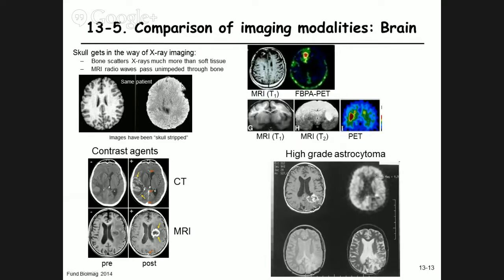It's got stronger contrast. Is that T1 or T2 weighted? I hear T2. Everybody agrees? Yeah, so this is also T2. The difference between these two is the echo time. So here's T1, post contrast. This is MRI T2, two different echo times. And we have FDG PET. And this is all the same patient.